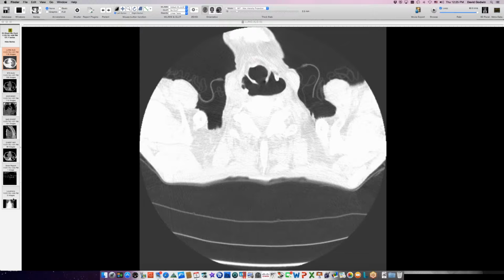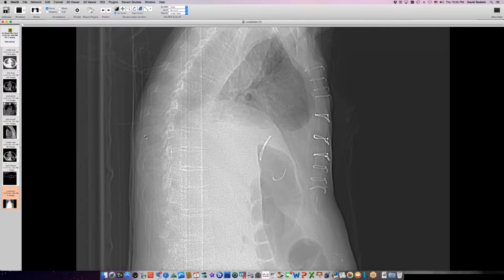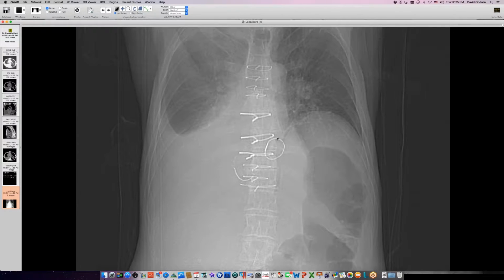We do. Okay. So here's the scout view of this man who has some respiratory distress, some shortness of breath after heart surgery at an outside institution. I noticed that earlier Seth made a big point about this being an outside case, which explains all sorts of things. And this fellow has this elevated left hemidiaphragm, so they wanted me to do fluoroscopy.